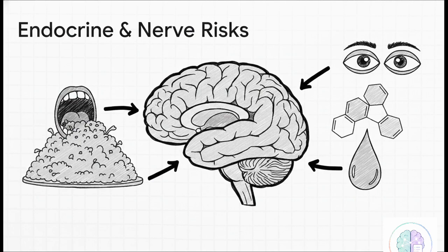Because we're operating in incredibly tight, delicate anatomical quarters within the third ventricle, even the most minor deviations can cause profound clinical issues. We can break these down point by point. First, the walls of this ventricle are literally formed by the hypothalamus. So, if the endoscope injures the hypothalamus, it can actually trigger hyperphagia, which is this extreme, abnormal, and totally uncontrollable drive to eat.